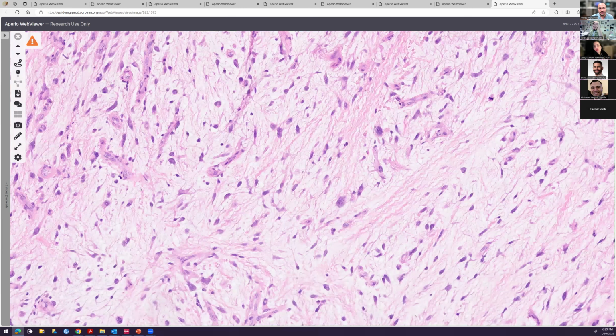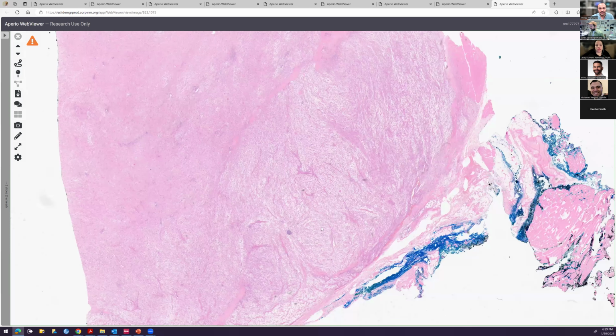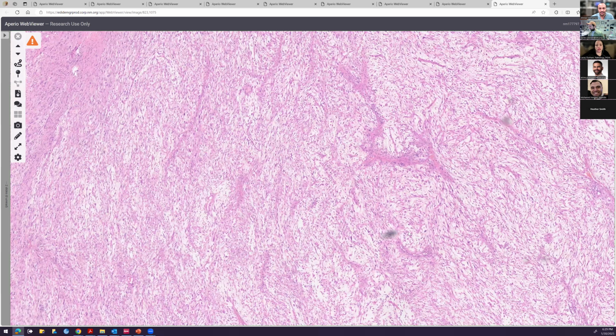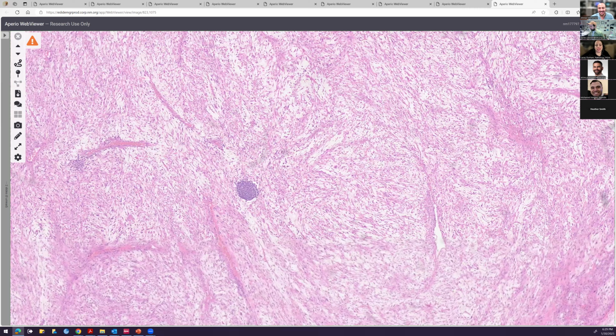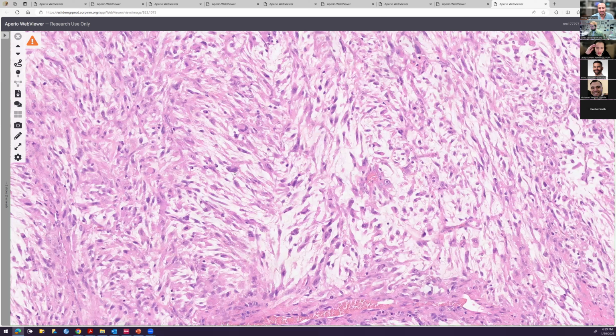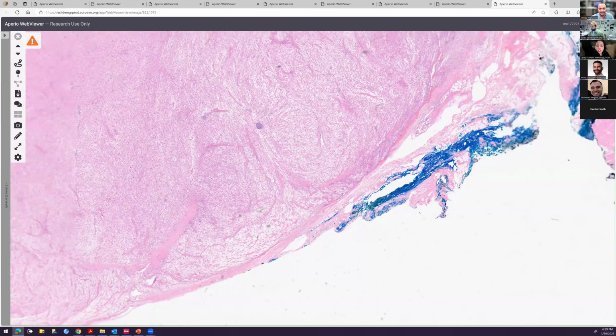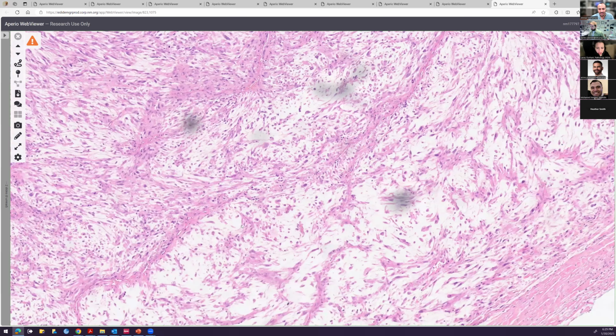Now this is an example of a low-grade myxofibrosarcoma. Generally, as these things get higher grade, you start to get less myxoid change, right? So here's an example of, I believe, an intermediate to high grade. And you can see the curvilinear vessels still running through the tumor, right? But then again, very pleomorphic spindle cells in this myxoid background that's getting much more cellular, right? And then over here, for example, a very myxoid, lower grade component.